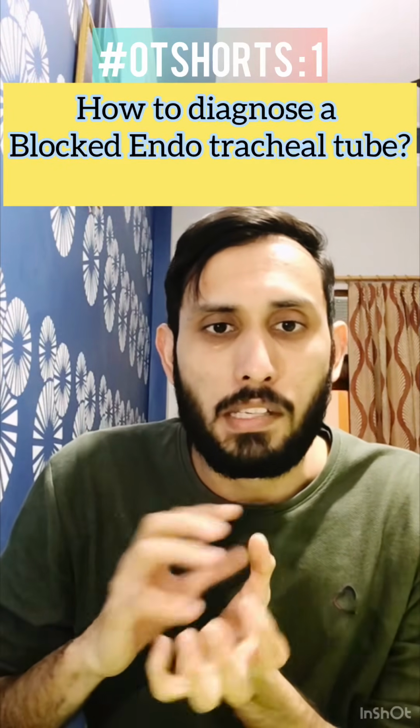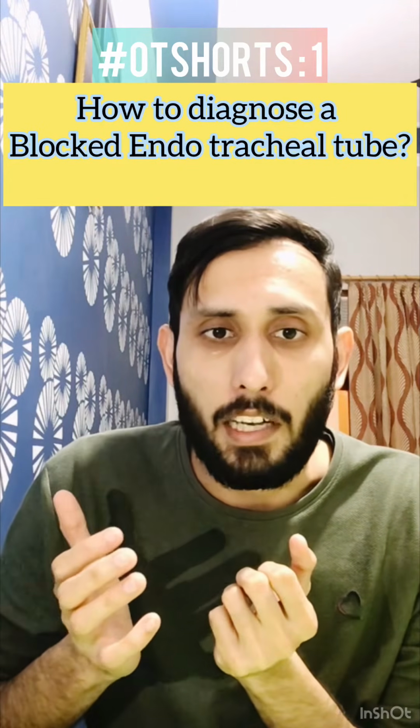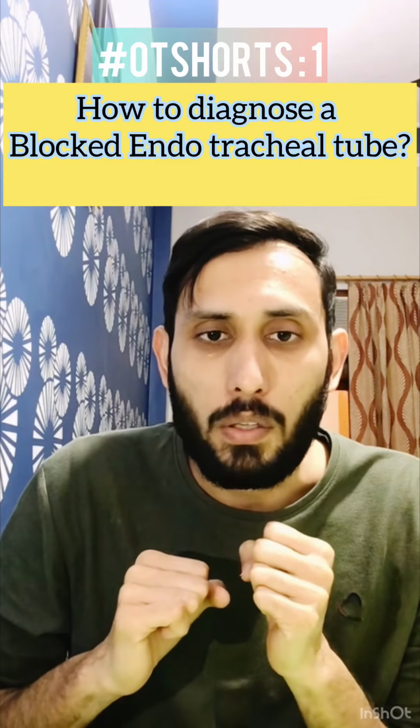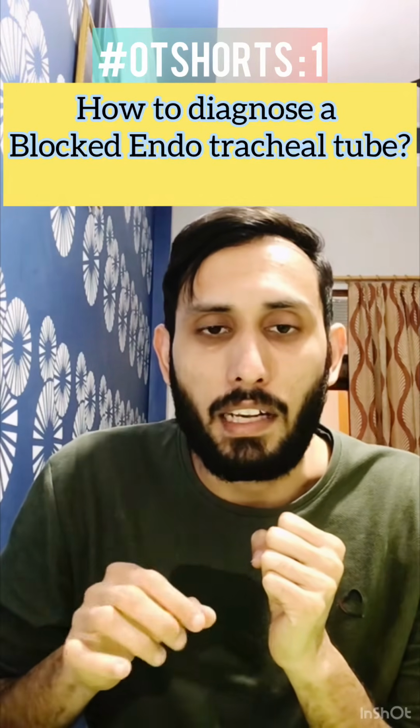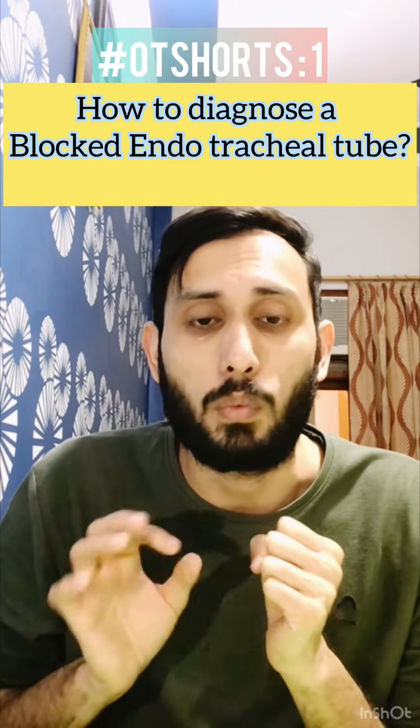If you are not able to press at all, that means either the tube has got kinked or it is completely blocked. You do a quick laryngoscopy. If the tube is not kinked anywhere, the only reason can be a completely blocked tube. You have to remove the tube and replace it with a new one.